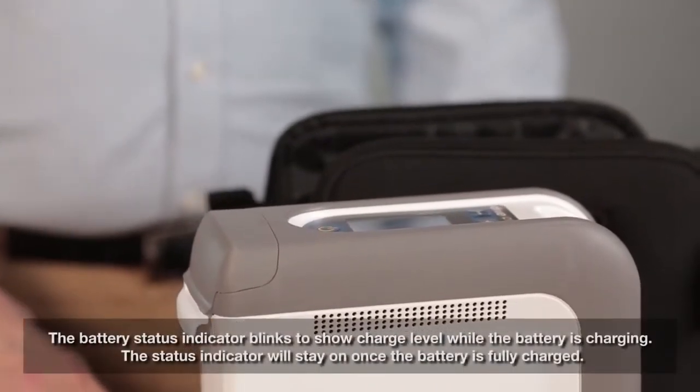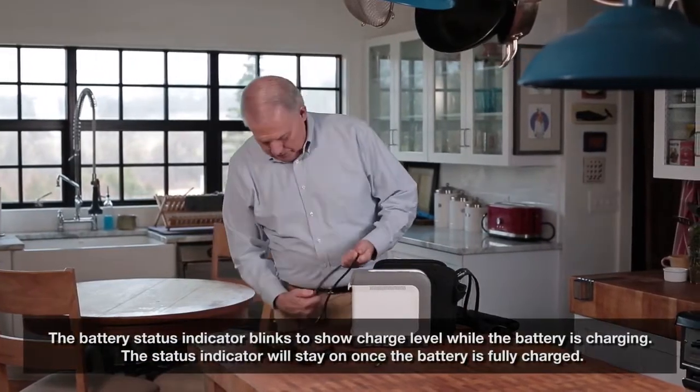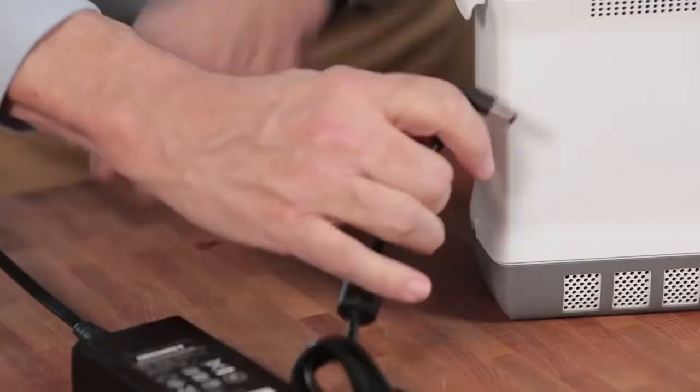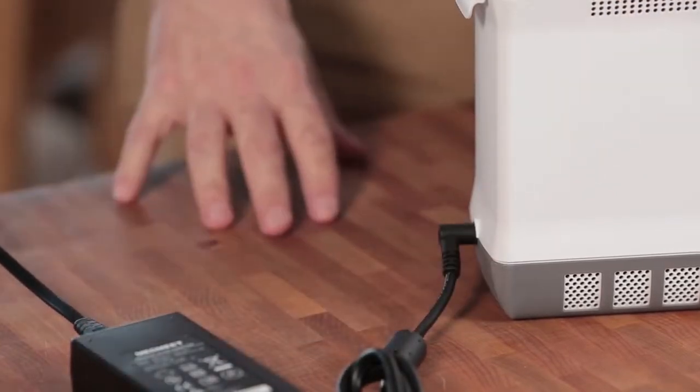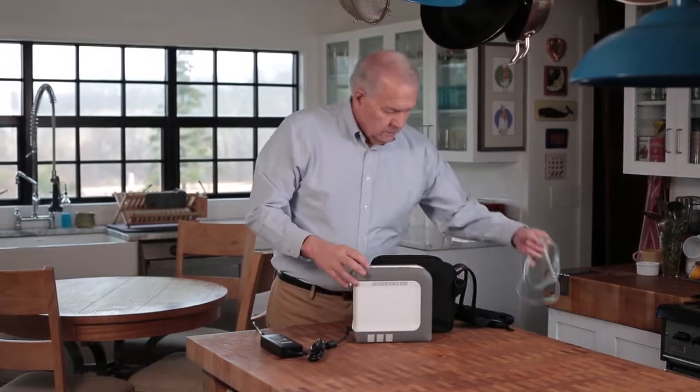Remember, before using your iGo 2 on battery power for the first time, the battery needs to be fully charged. To charge the iGo 2 battery, simply attach the power supply to the iGo 2 and plug the unit into a wall outlet or car charger using the appropriate power cord.